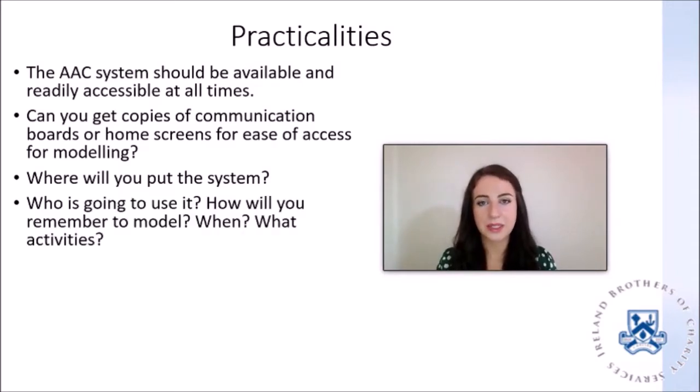Who is going to use the device? How will you and they remember to model? When and in what activities? This one in particular can take a lot of planning at the start, and you might need to actually write out the plans for who is going to model and what words they're going to model, but it becomes more automatic as you get more used to the device. I'm going to speak about making those plans later on in this video.